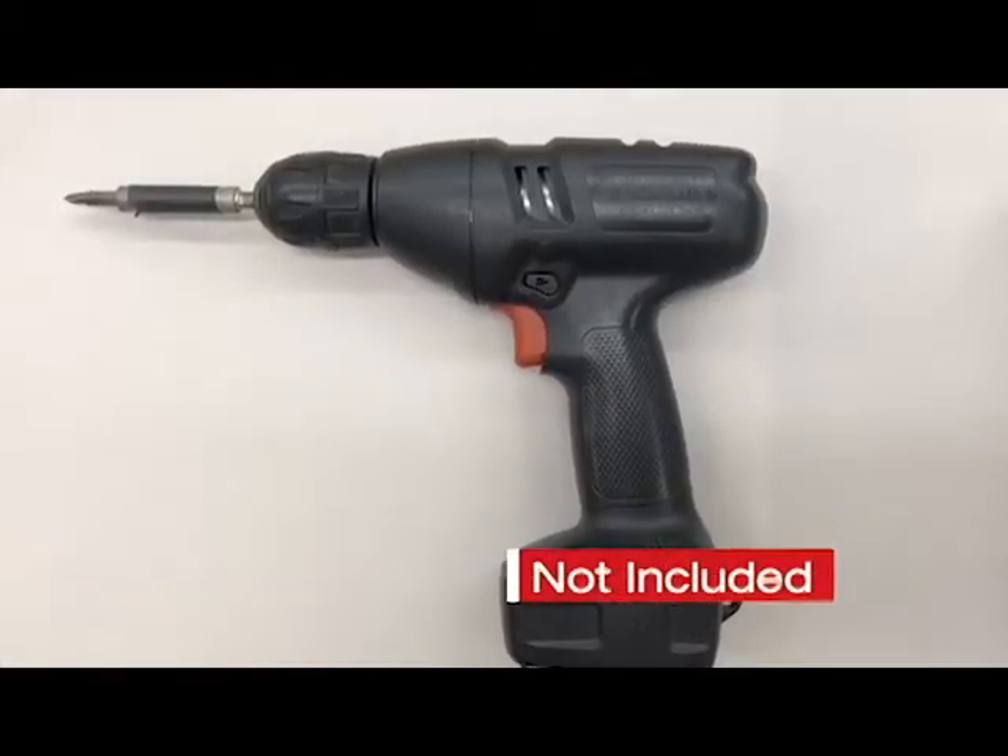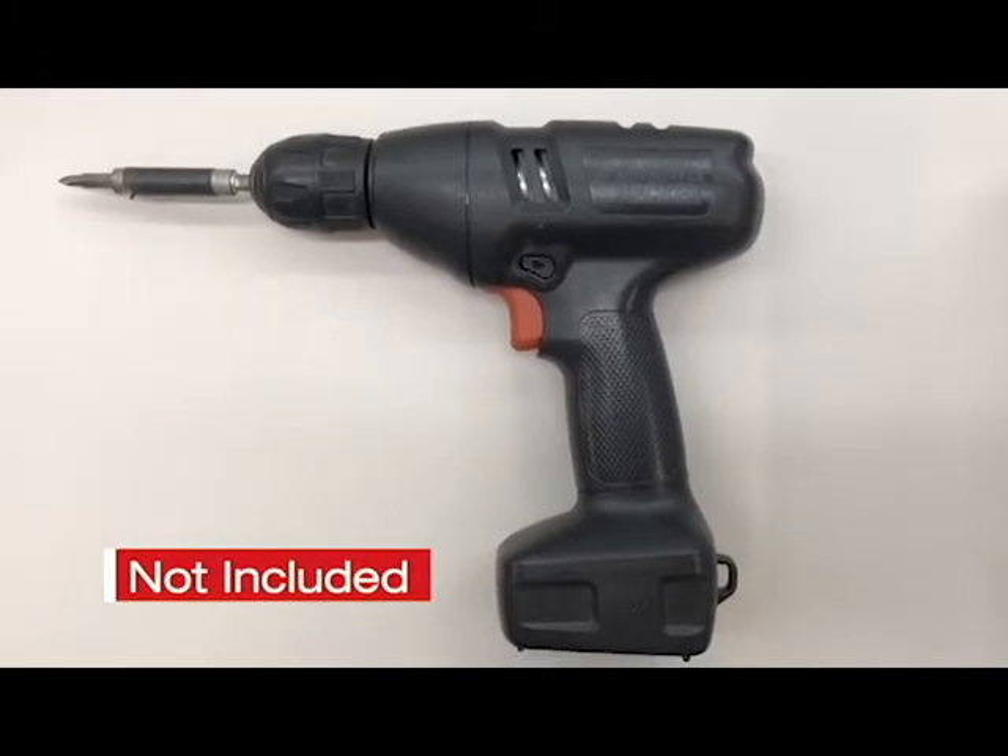For the installation, and not included, you will need a standard Phillips head screwdriver or drill.